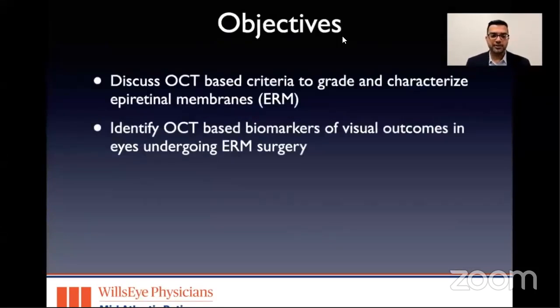The objectives today are to discuss an OCT-based criteria to grade and characterize epiretinal membranes and identify OCT-based biomarkers of visual outcomes in eyes undergoing epiretinal membrane surgery.